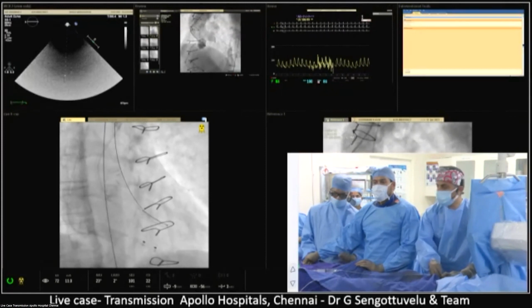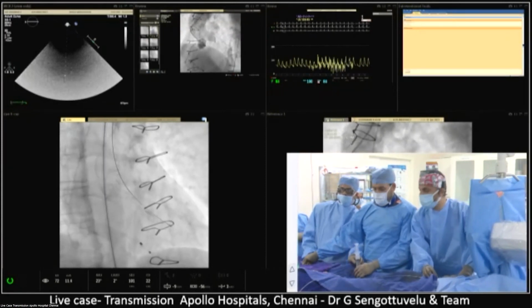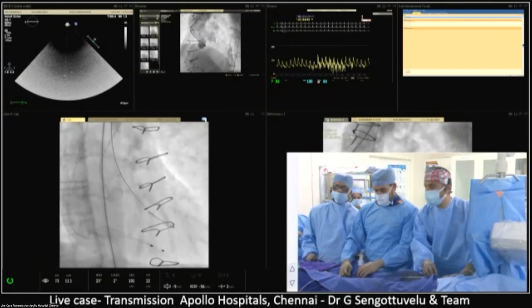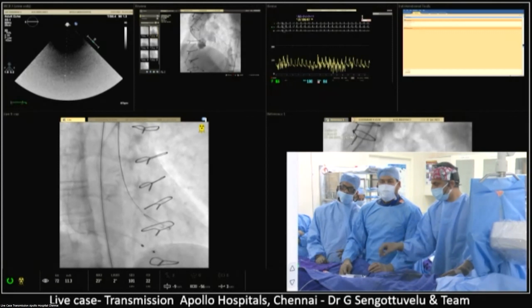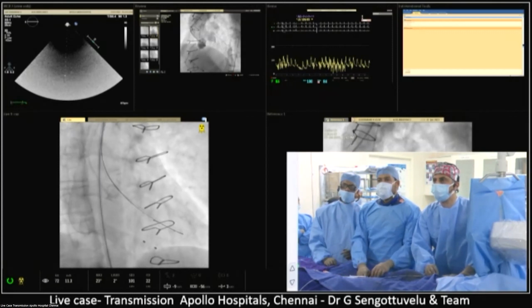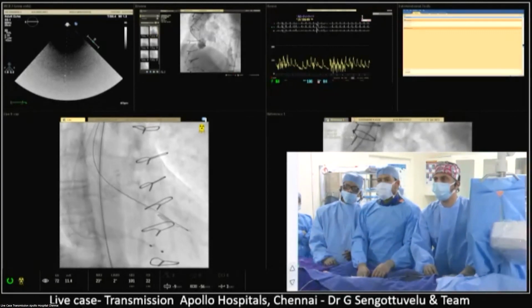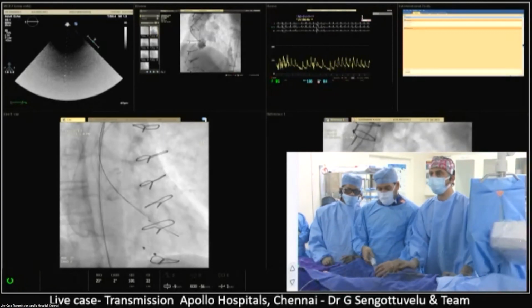So you put a pacemaker from the neck. We normally don't need pacing routinely for Accurate Neo valve, but for pre-dilatation and also sometimes during the final deployment, we need to push the wire a little bit. Okay, cross. Okay. Connect. Ready? Pacing on.